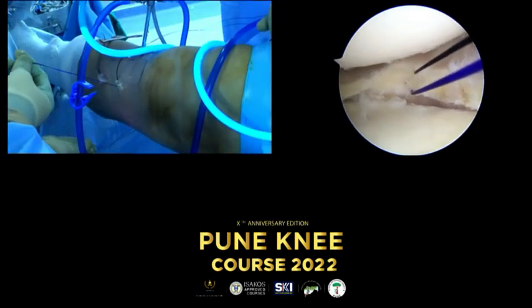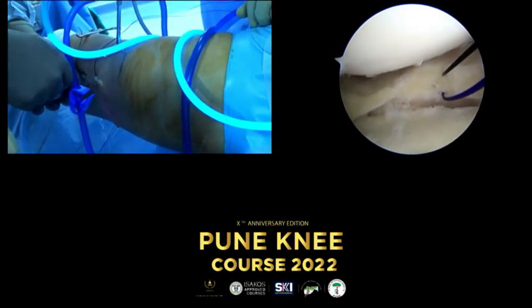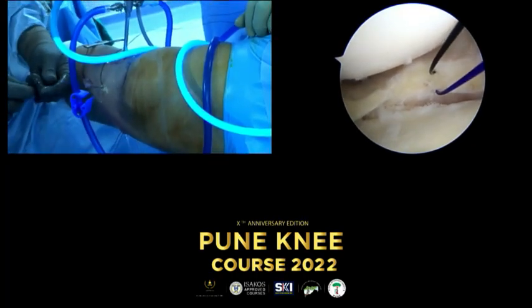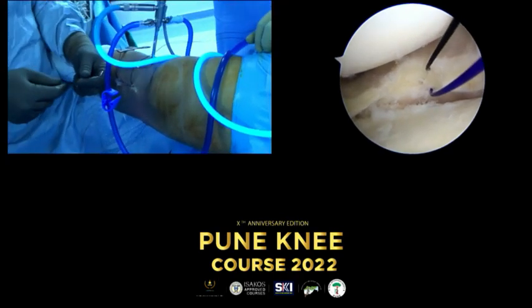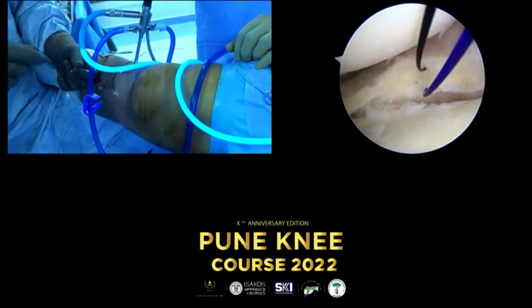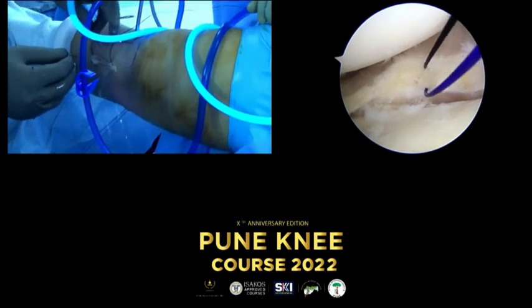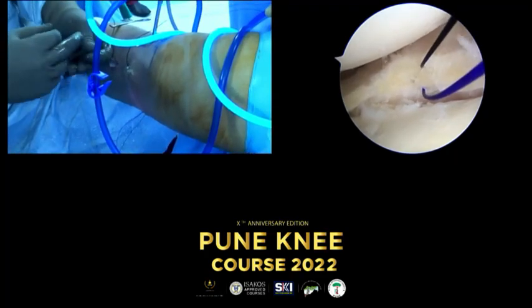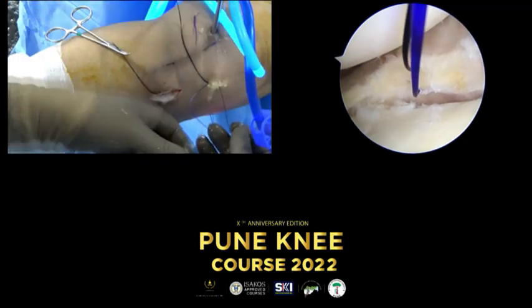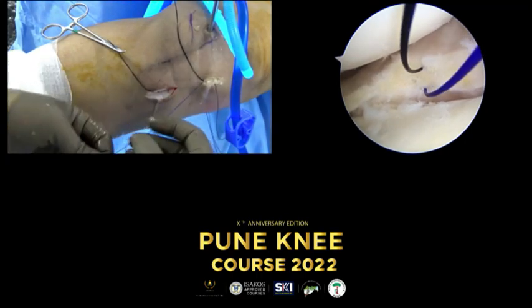Okay, so now I will request our beautifully prepared allograft with a Sachin name with heart on it. You have to draw something on the upper surface, because sometimes you can be struggling when the graft is inside. You don't know which is the anterior part, the posterior part. Sometimes it can be upside down.